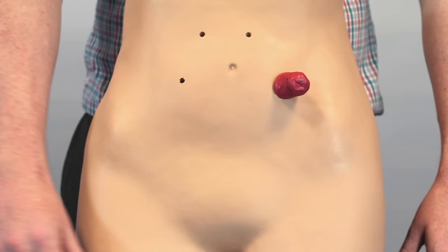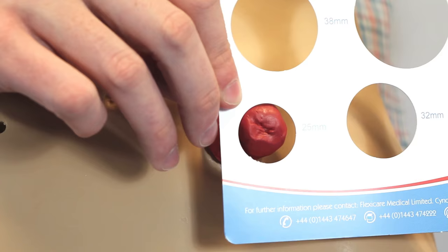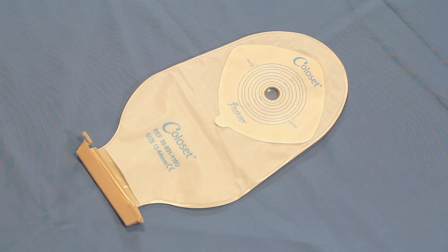When applying a one-piece pouch, the first step is to measure the stoma so that you get the right size. It shouldn't be too close to the stoma, nor should there be a lot of space around it. It should fit very close, with about an eighth-inch clearance between the stoma and the barrier.